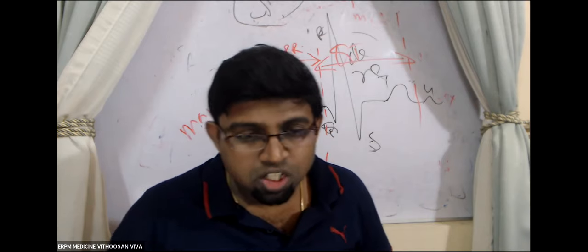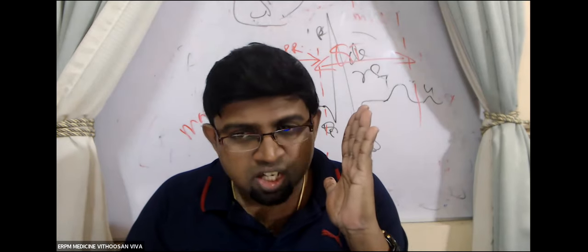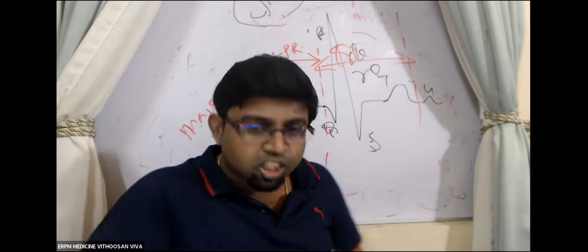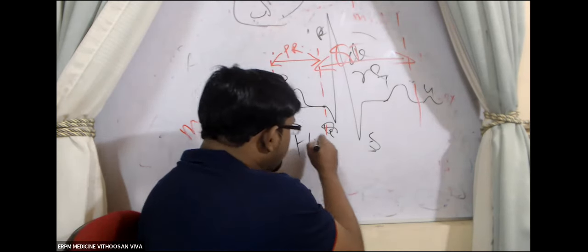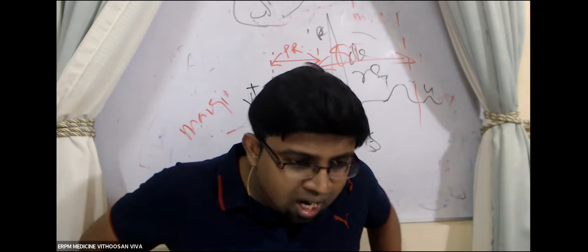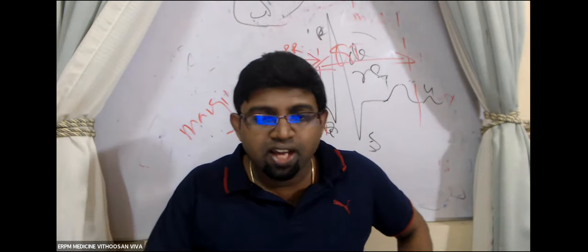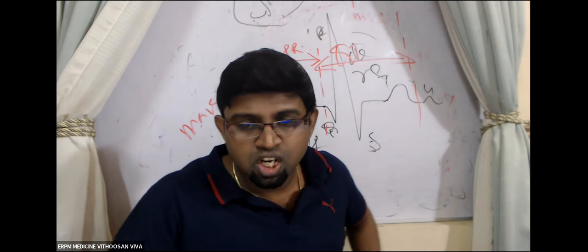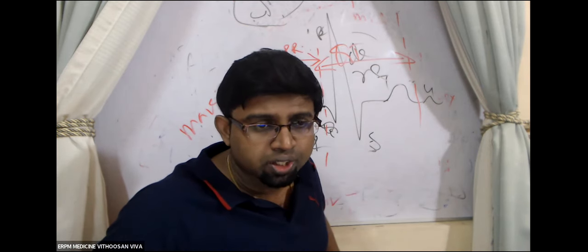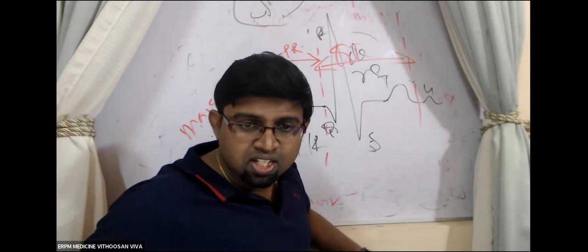Clear? My next point. Look here. The point about this QT interval is that it depends on your heart rate. In other words, when the heart rate changes, the QT interval changes.